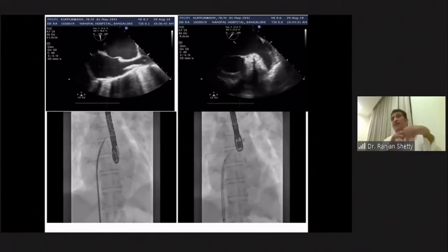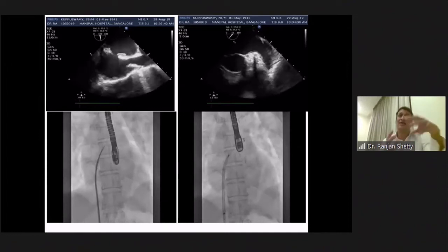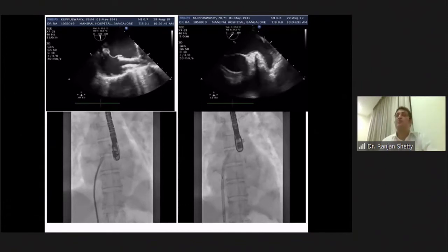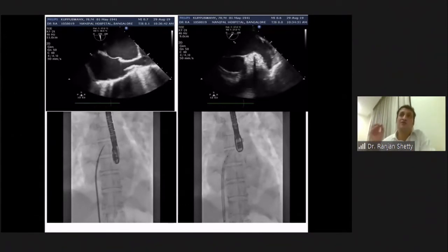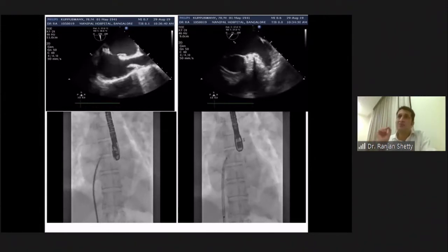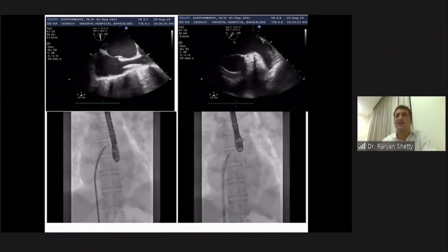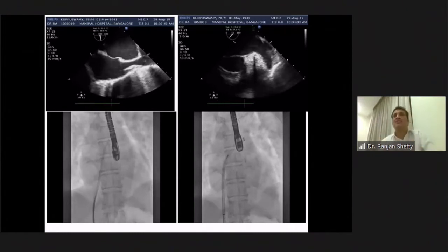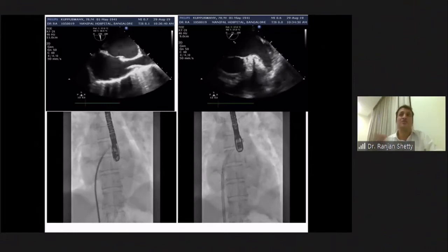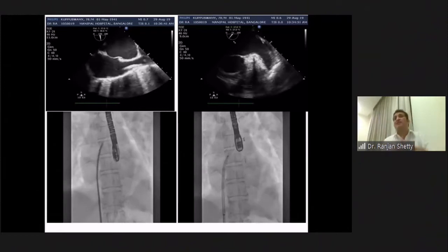Now there are times your catheter slips when you do that. If you can puncture it easily, it's okay, but there are times when it slips. What you could do when it slips is, again, obviously reposition. You could take the opposite end of the 014 wire, the hard end, just puncture the septum, then put the soft end of the 014 or any of your coronary wires, and on that you could push the whole system in. Or you could also use a cautery and touch it to the broken Brockenbrough needle. By doing any of these techniques, you will enter the LA.